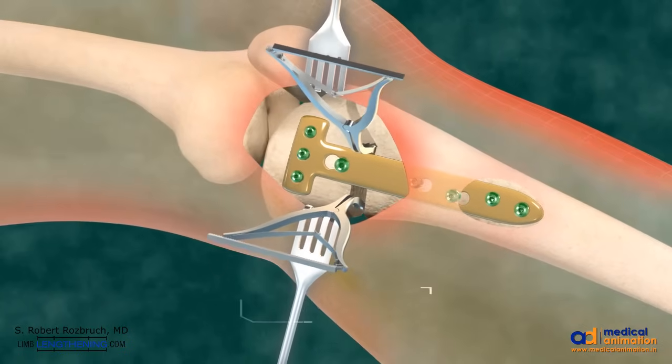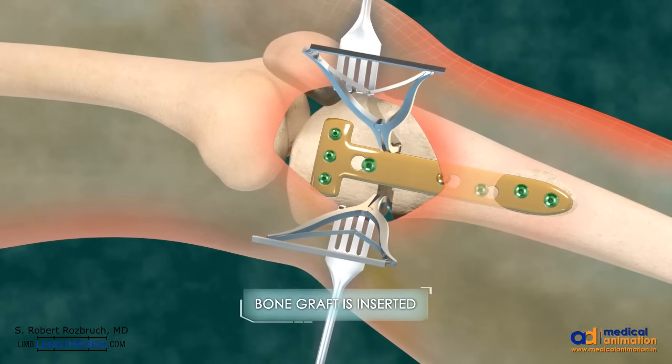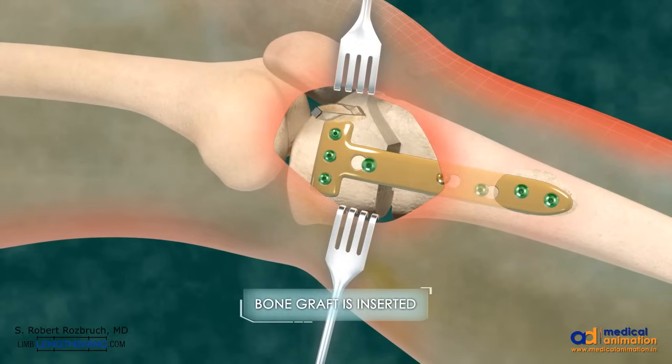Once all the screws are in place, the laminar spreaders can then be removed and bone graft is then inserted into the open wedge. Again, the lateral cortex has not been cut. This osteotomy and correction is based on the concept of hinging on the lateral cortex.